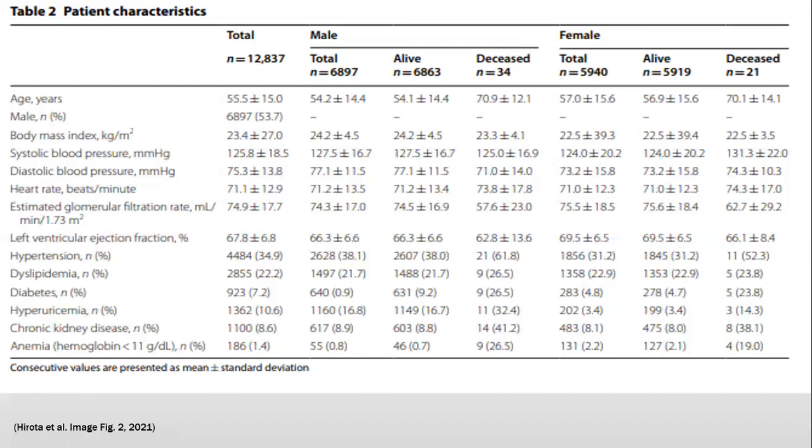And also the parameters that they used, they were using a specific ECG machine. It was a General Electric machine. I'm assuming the hospital just had one type of machine in use there. So if they were to look at this data using a different hospital with a different machine, the approaches to how you look at the data or any algorithms used to measure the waves could be different based on the manufacturer versus the GE machines they used here.